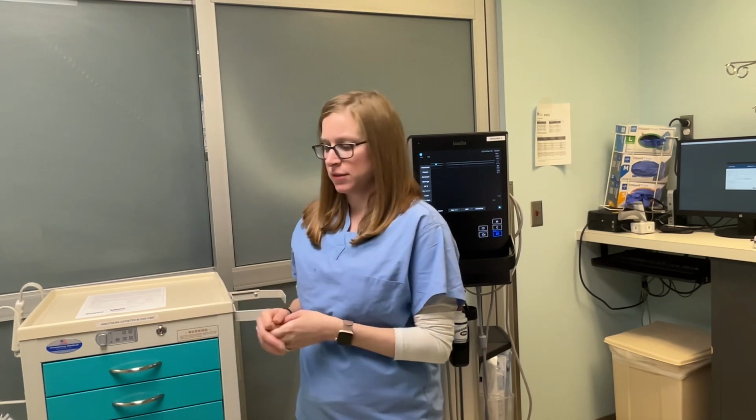Once anesthesia has gotten their stuff out of the cart and they are all set up for the procedure, you'll perform the timeout. Make sure that you take note of the time that you are performing the timeout so you can document it in the computer. And that is the setup for the catheter placement in PACU.